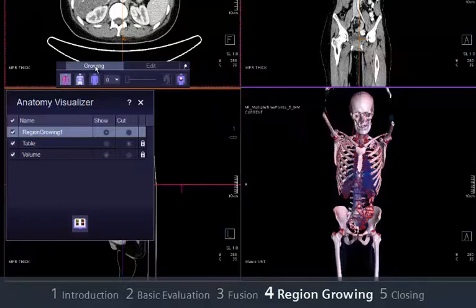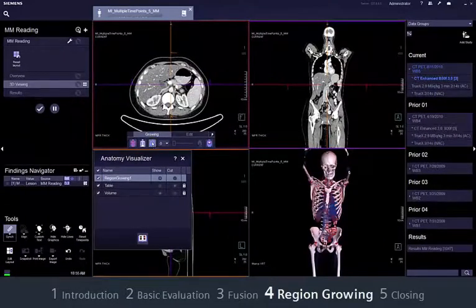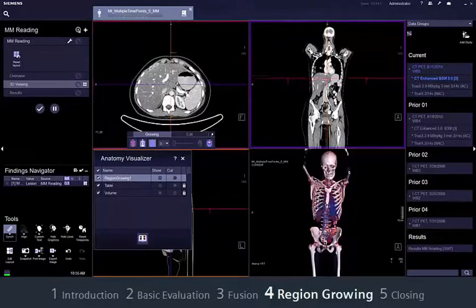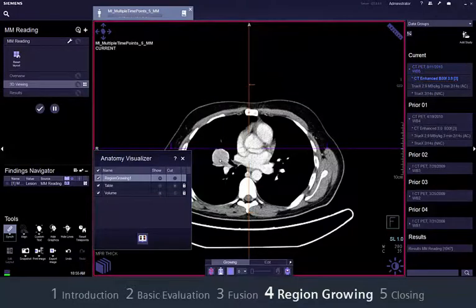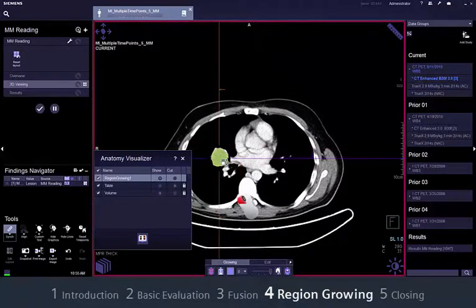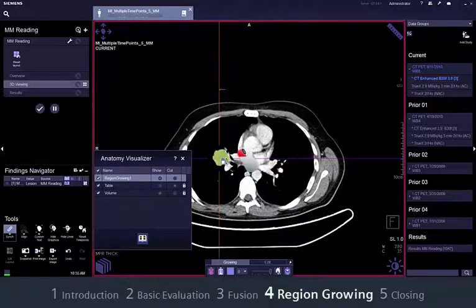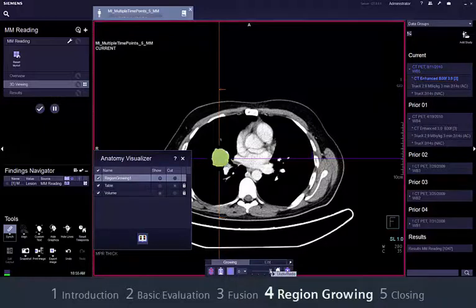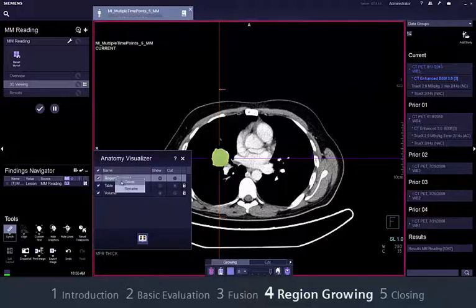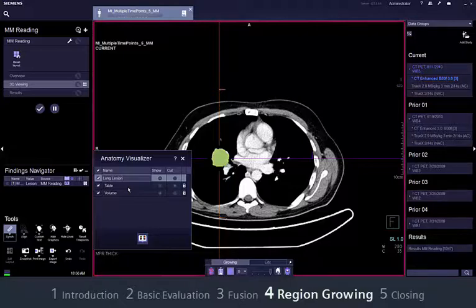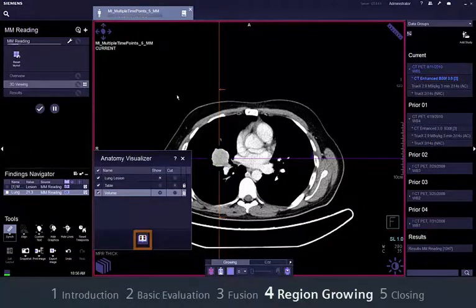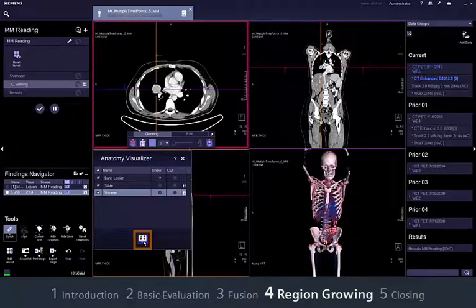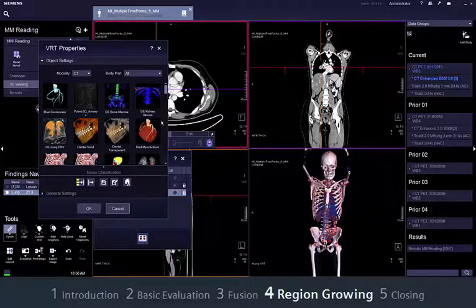Now define the structure to be segmented. For a tumour, select General or Organ. It is recommended to magnify the image before starting. Now segment the lesion. If necessary, correct with the slider. When finished, enter a proper name in the table of the Anatomy Visualizer. If you want to show the lesion in the anatomical environment, for example to a surgeon, a different VRT display may be more suitable.